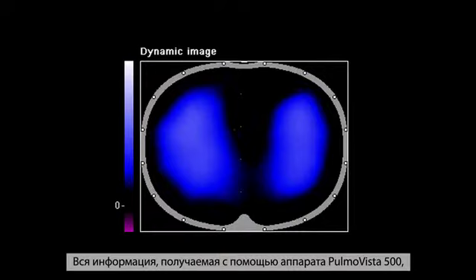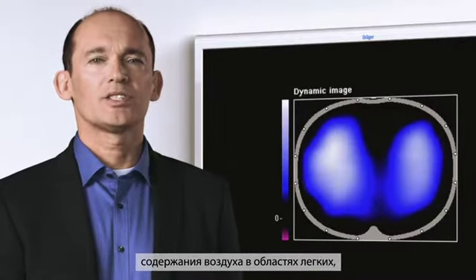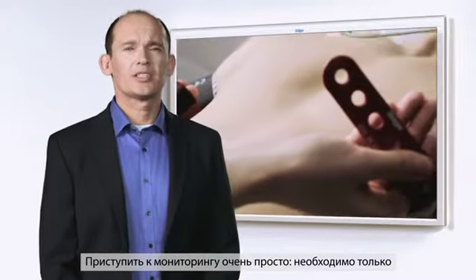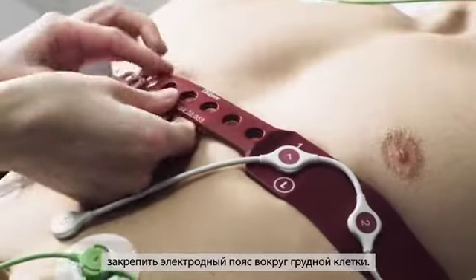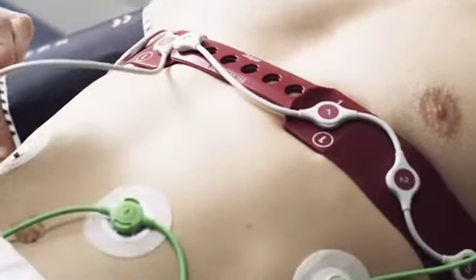All the information displayed on PulmoVista 500 relates to the ventilation-related changes of air content that occur in the area covered by the electrode belt. It's easy to get measurements underway. The belt is simply applied around the chest and then measurements can be started. An automatic calibration individually optimizes image generation.